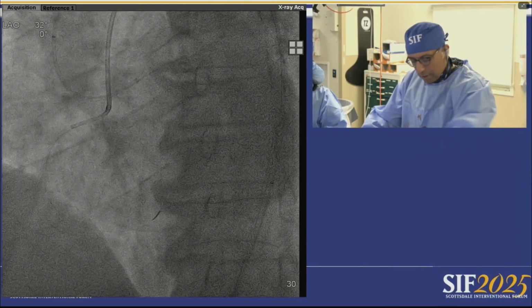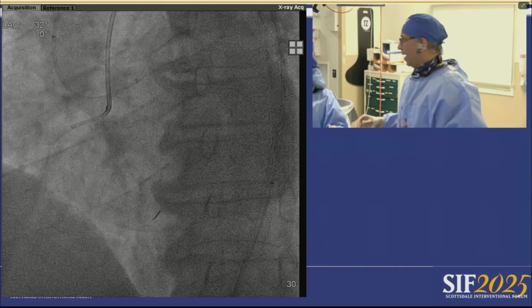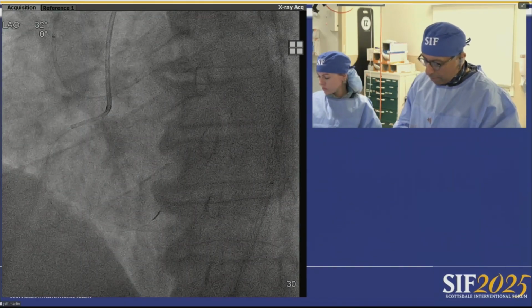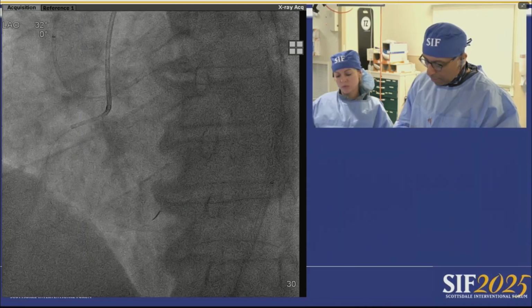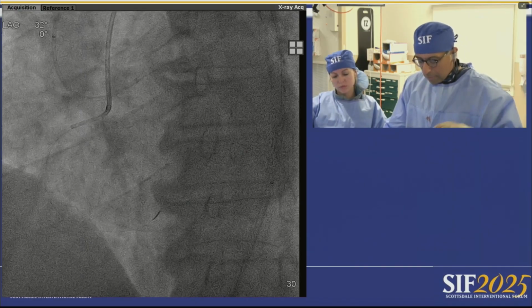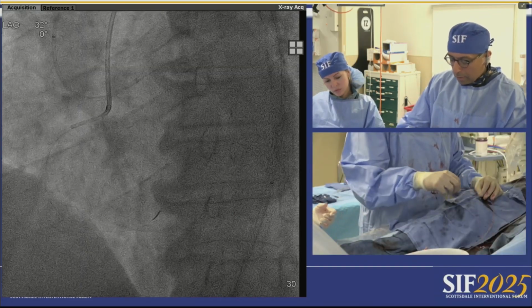So I think at this point, you're either trying to IVUS right now to see whether you got fractures, and the IVUS catheter will pass better. You go to a next higher size and shorter non-compliant balloon to see whether you can expand that better. You utilize a specialty balloon like a sculpting balloon or a cutting balloon, or you just jump to Shockwave, depending on your situation in your lab and how much you're going to be judged. But I'm not sure I would go to rotablator or do that again. That's the decision-making point right now, because we've got to maximize this and we've got to keep it open.